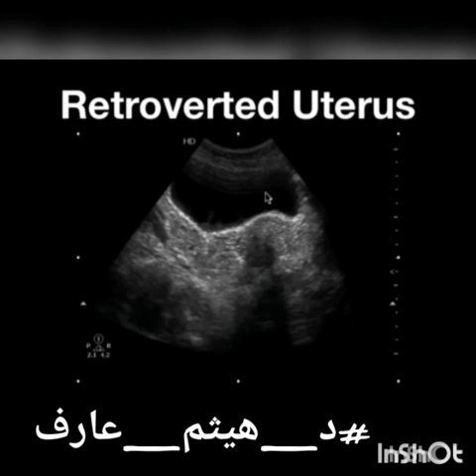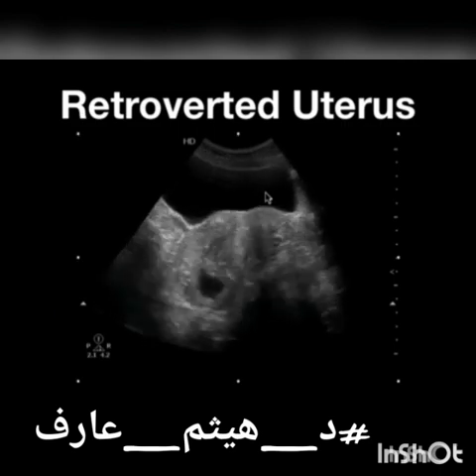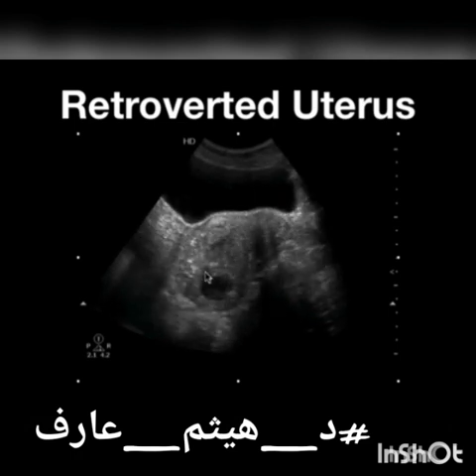Here we have a patient with a retroverted uterus. You can see here as we sweep, anterior, posterior, head and foot. Here's urinary bladder. Here's going to be vaginal canal into cervix, now going into the uterus. You can see the myometrium here. You can see here is a sac within the uterine fundal region, but you can see that the uterus is tipped back posteriorly.